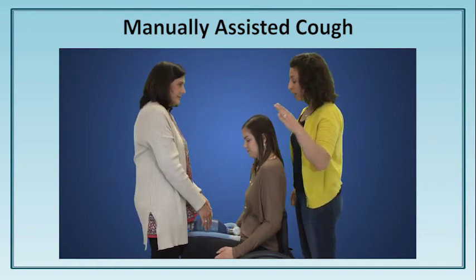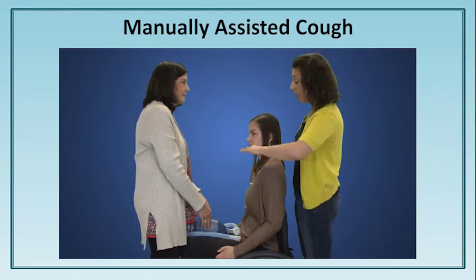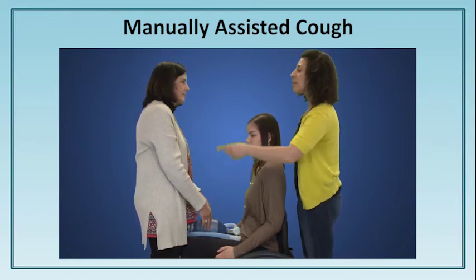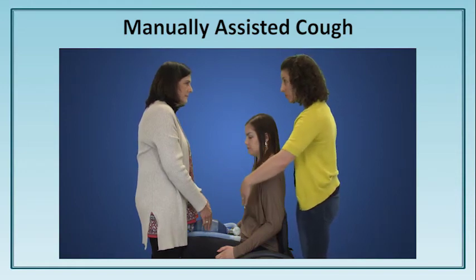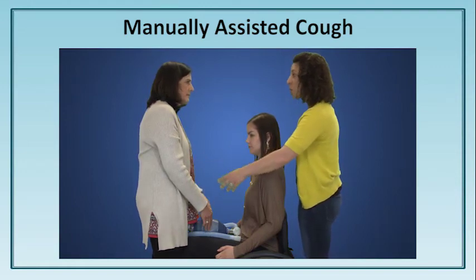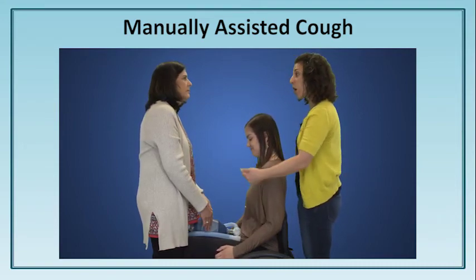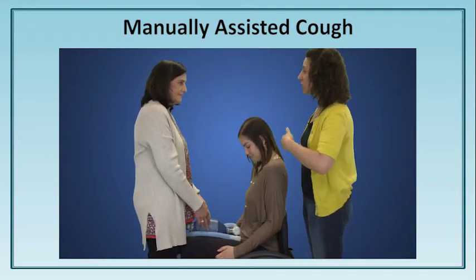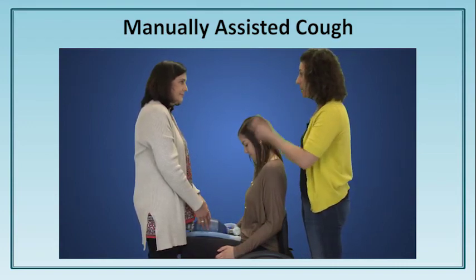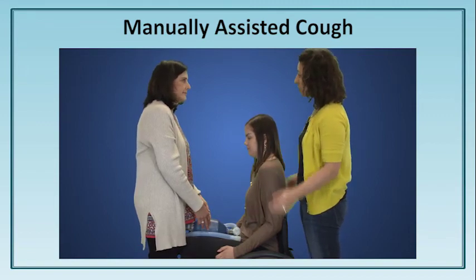You were able to squeeze the bag four times to cause full chest rise for Emma all the way up to her collarbones, and because your body was already in position with one hand on her stomach over her belly button, you were able to easily transition from pumping the bag to helping her with a cough. Also notice that as Emma coughed, the mouthpiece naturally came out of her mouth and she was able to cough after receiving the full breath. Good job.